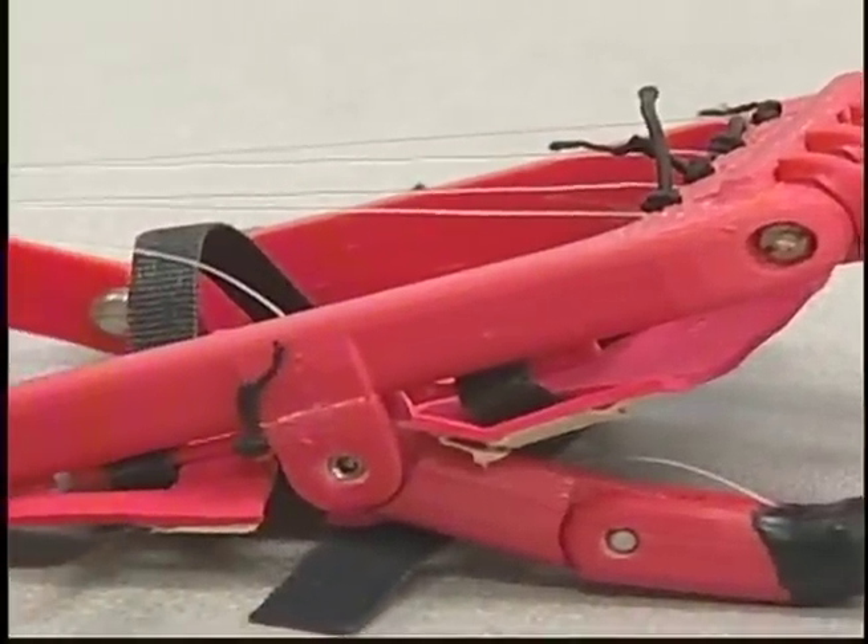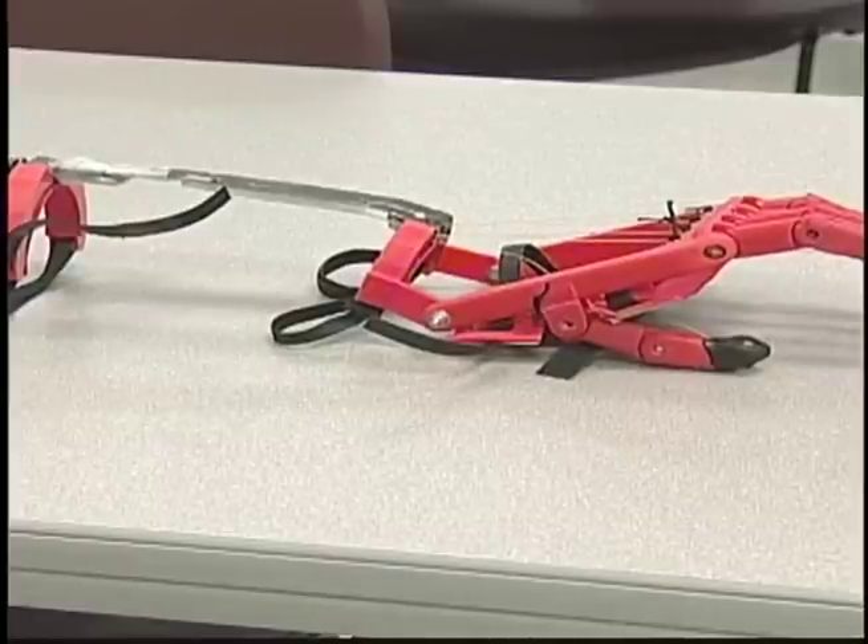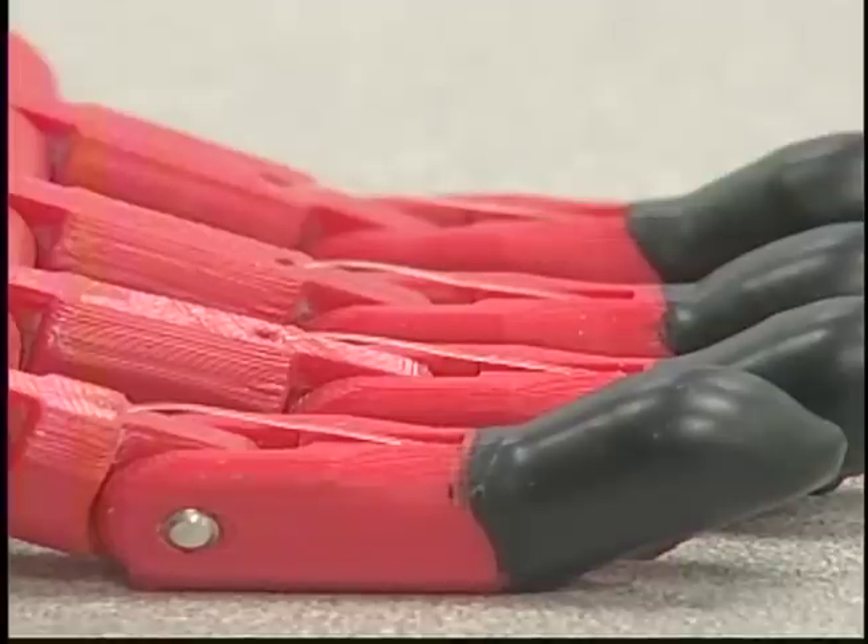Doctors at Texas Scottish Rite Hospital approached Dr. Hunt with the idea of redesigning the model, and she passed it along to her students. It took a full semester of research. The modeling and the 3D printing is stuff we already knew about, but to use it towards actually helping someone out — helping them with something that's going to benefit their lives — it's a little bit different in that way.